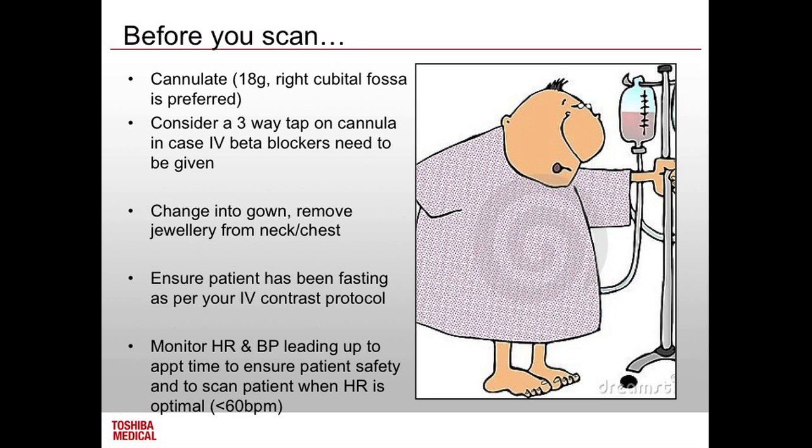Question, just back to, if they can't put their arms above their head, would you still do it? I would have a chat with the referrer or ideally the radiologist. Depends on the size. If they were massive and they couldn't get their arms up, they probably wouldn't fit through the scanner anyway, potentially. But I'd probably still give it a crack, to be honest, because the dose these days is so low.